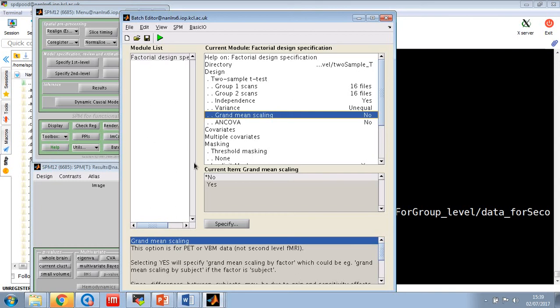We don't do that in fMRI. Again, the signal itself isn't quantitative. It doesn't mean anything specifically, whereas in PET, it's kind of a measure of the radiation or blood flow. Same with perfusion maps, or same with VBM, where it's a matter of grey matter content.